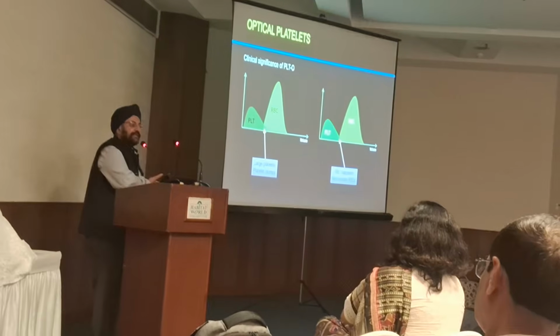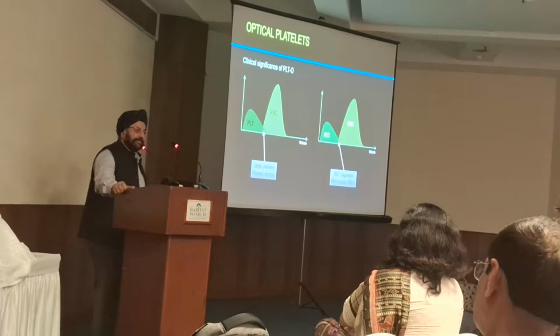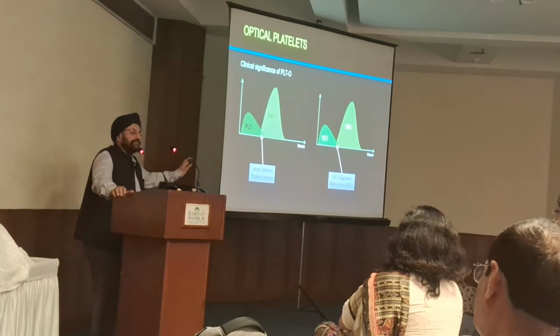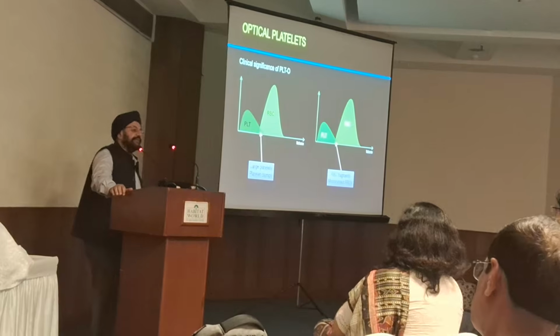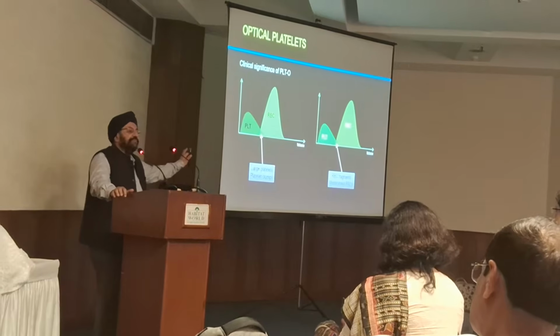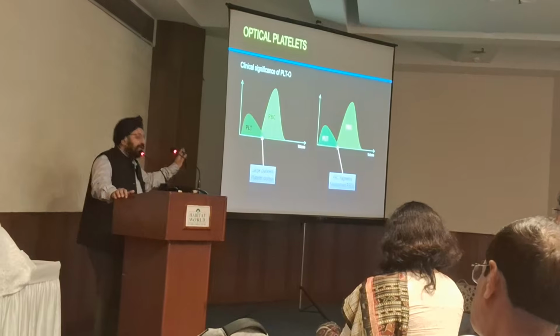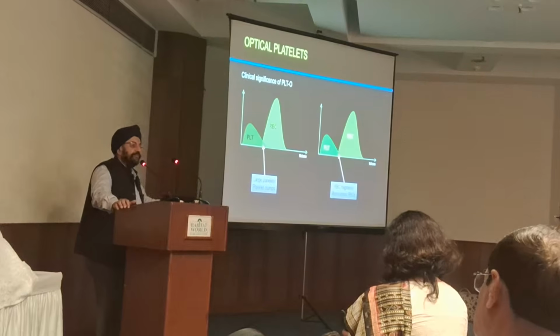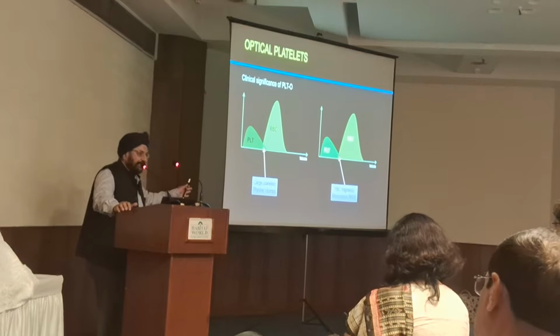RBC तो already 40 लाख थे, 40 लाख 50,000 रिपोर्ट करते हैं. But if you count 50,000 less platelets, so say a difference between 80,000 and 30,000, it's a chalk and cheese situation. So that is why these impedance platelets don't work in dengue or any other cause of peripheral platelet destruction. You need to do a second method, which is either optical fluorescent or smear validation, whatever.